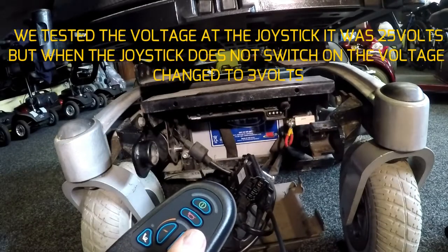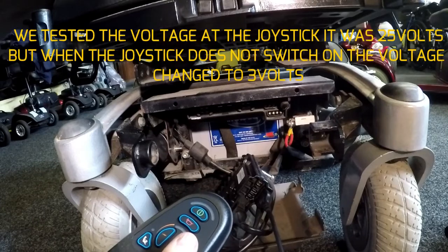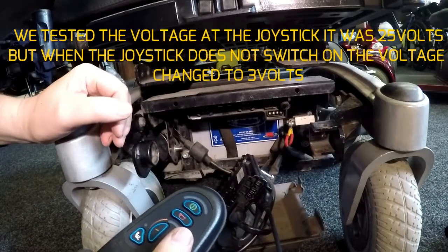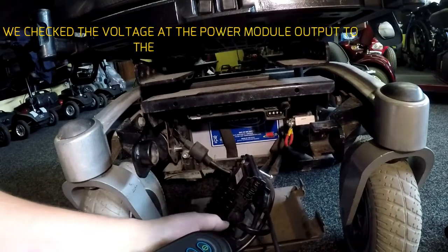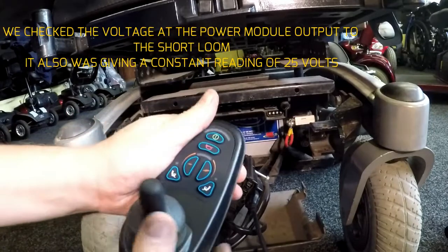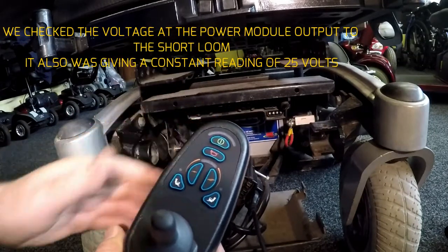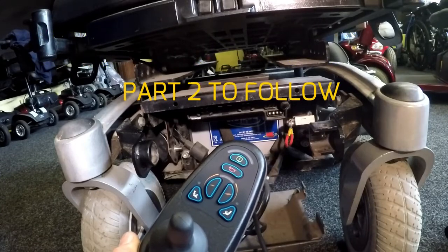Well, this one's going to be a little bit of a hassle. So what we just need to do is get a multimeter out, make sure that everything is connected, should be connected. Proper voltage coming here. We know there's 25.5 volts coming here, so there must be 25 volts coming here, but why is it not switching on? It's a nightmare. Anyway, we'll get a voltmeter down and check every single connection on the chair.